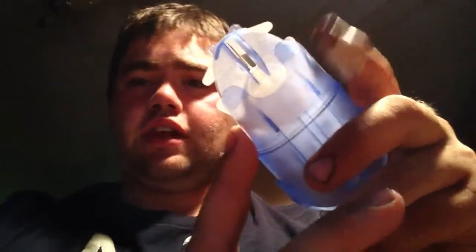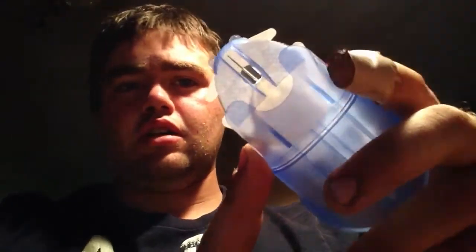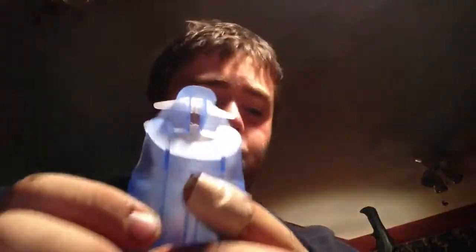The leg sites hold pretty well. Some people put their sites on their stomach. Some people I've seen on the arms, but I prefer on my legs, and it keeps them out of sight. And when I'm working, say, a professional job or something like that, if it's on my stomach, it's really hard to tuck in a shirt. So I much prefer my leg sites. So what I'm going to do, I think I'm going to stand up here.